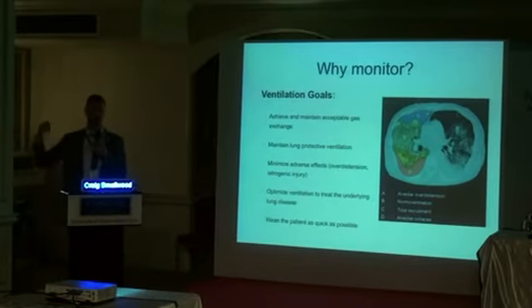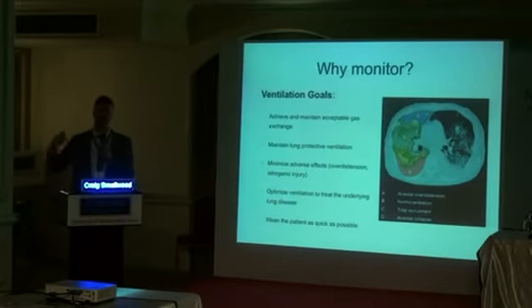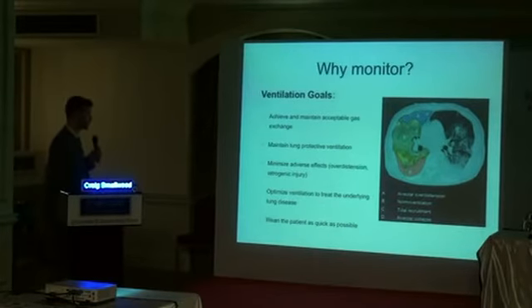But what we're moving into now is individualizing the care for individual subjects. So you have a subject who presents to your NICU or PICU with a specific disease. Well, it's no longer going to be enough to look to a guideline and apply a kind of cookie cutter guideline. We're going to look at specific metrics, differences in how that patient looks clinically, and apply tailored therapies on the mechanical ventilator as well as medication therapies to optimize care. I think that's where we're going. We're not quite there, but we will get there.